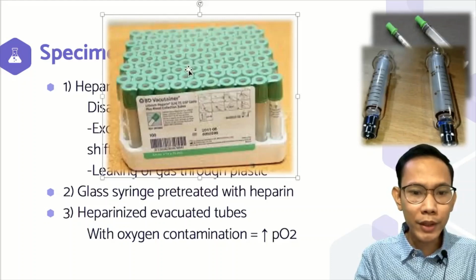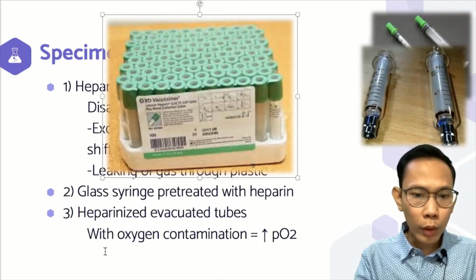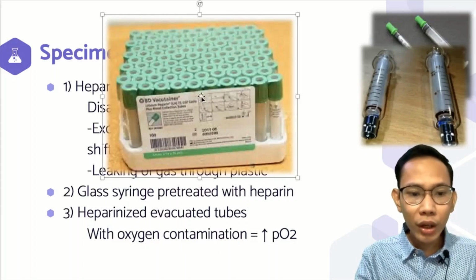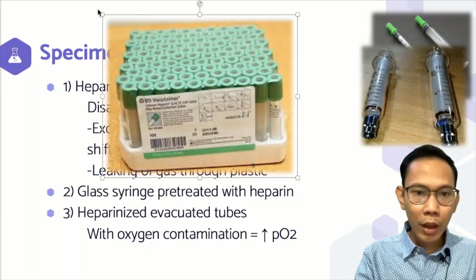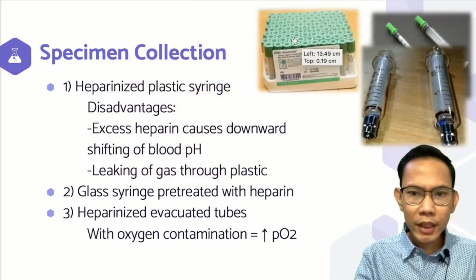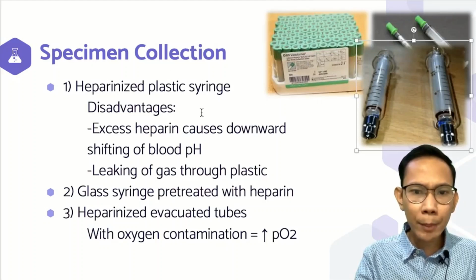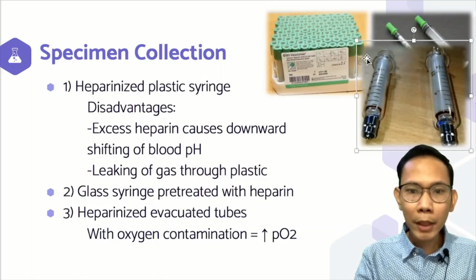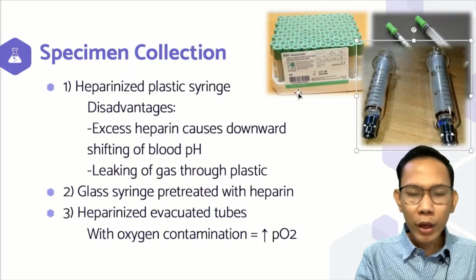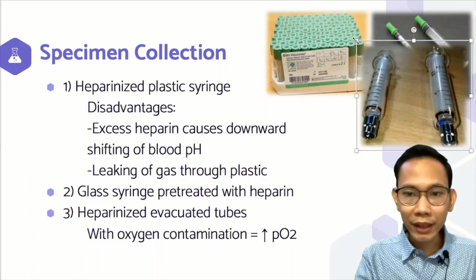The problem here is that it can lead to increased PO2, possible oxygen contamination. So for me, what is really preferred, in terms of easy usage, availability, and resources, is your heparinized plastic syringe. But you have to take precautionary measures for these disadvantages.